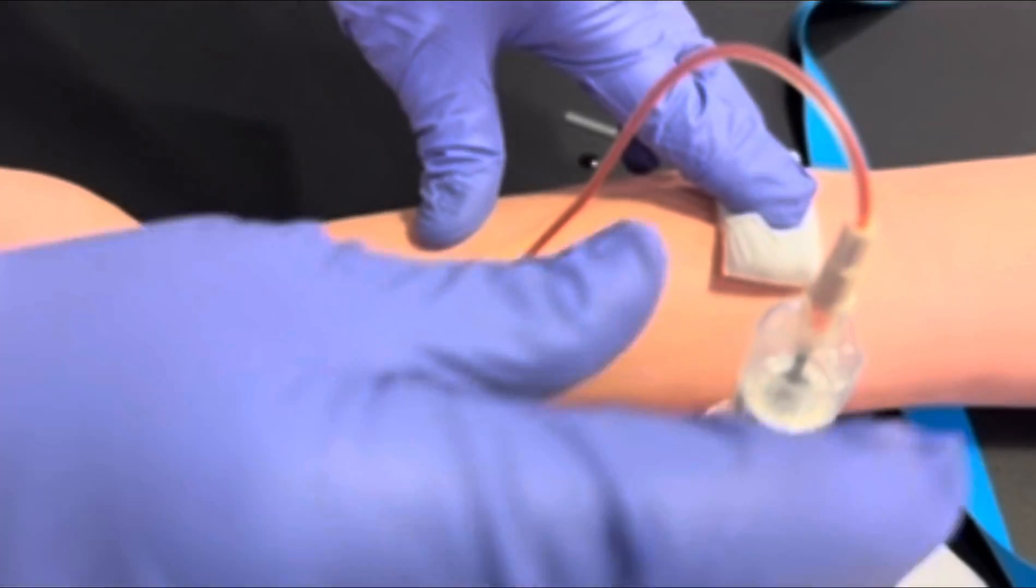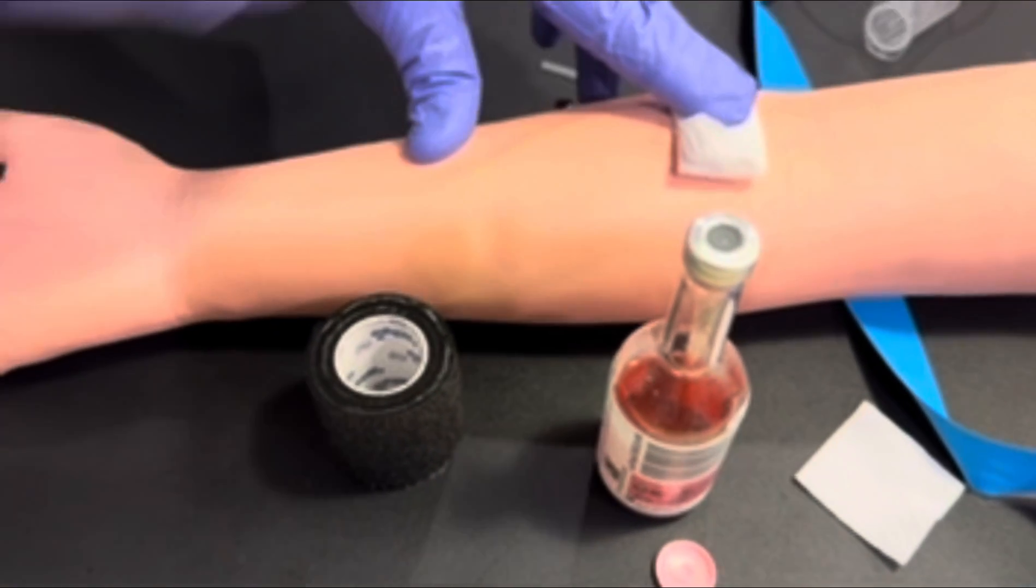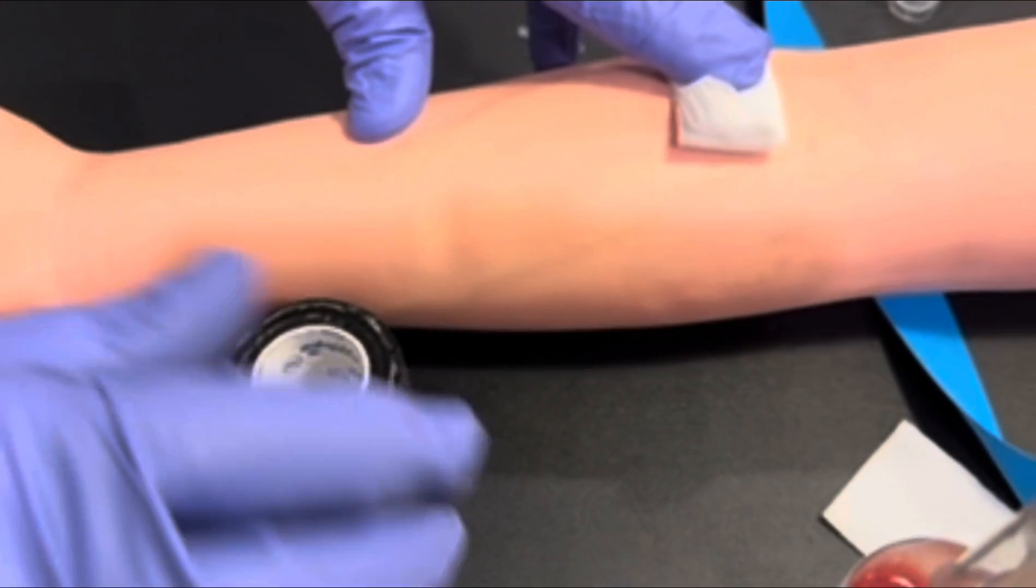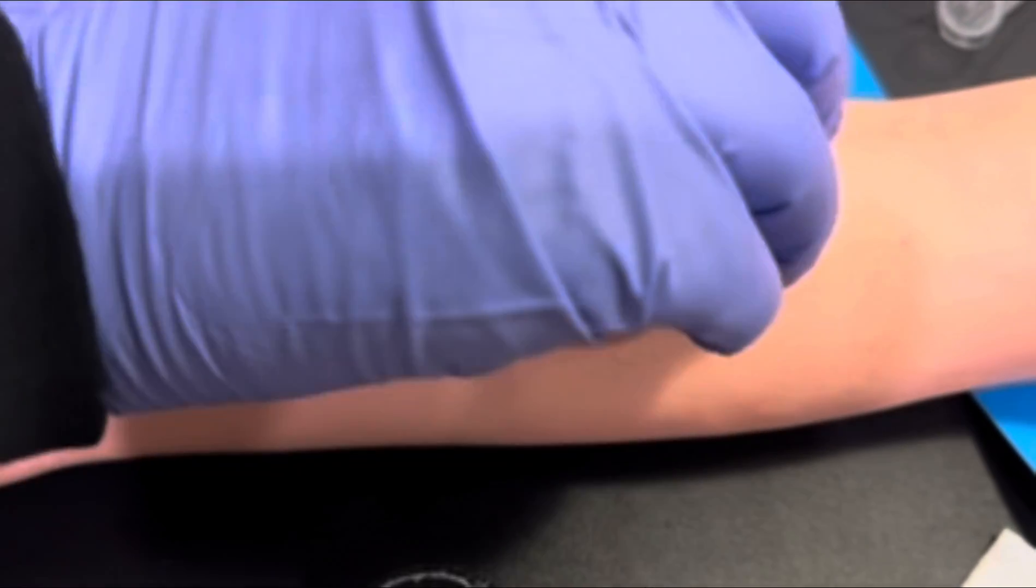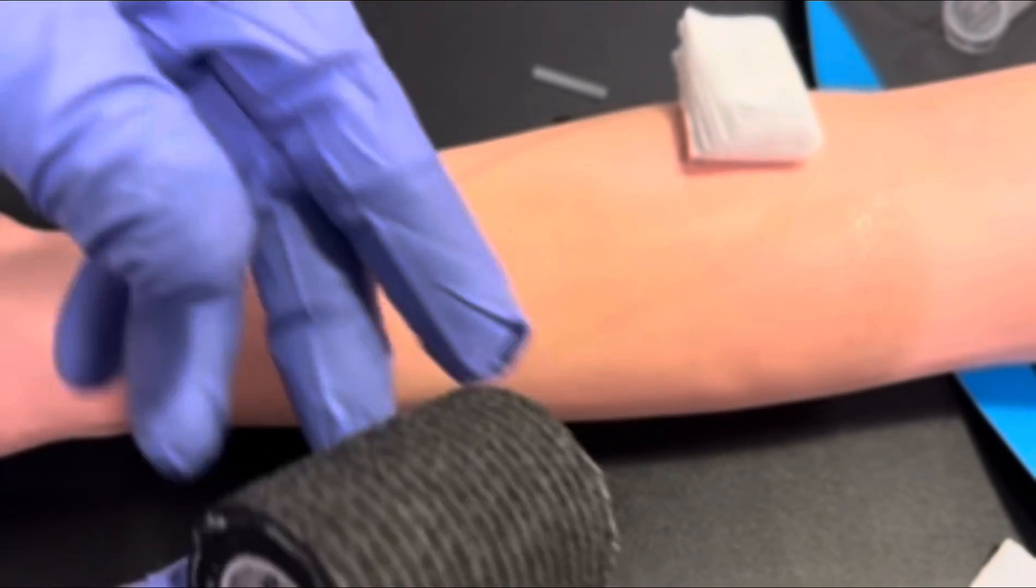Retract your needle. Apply gauze to the venipuncture site. Assess the site to make sure that it's stopped bleeding.